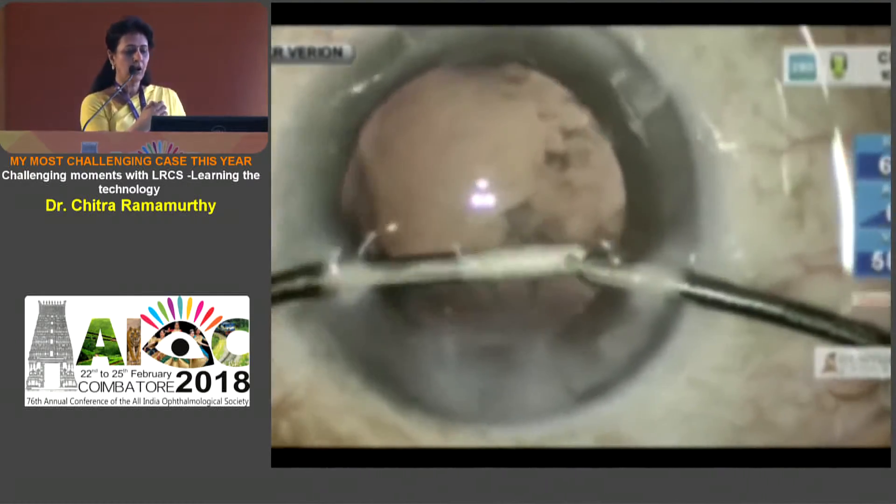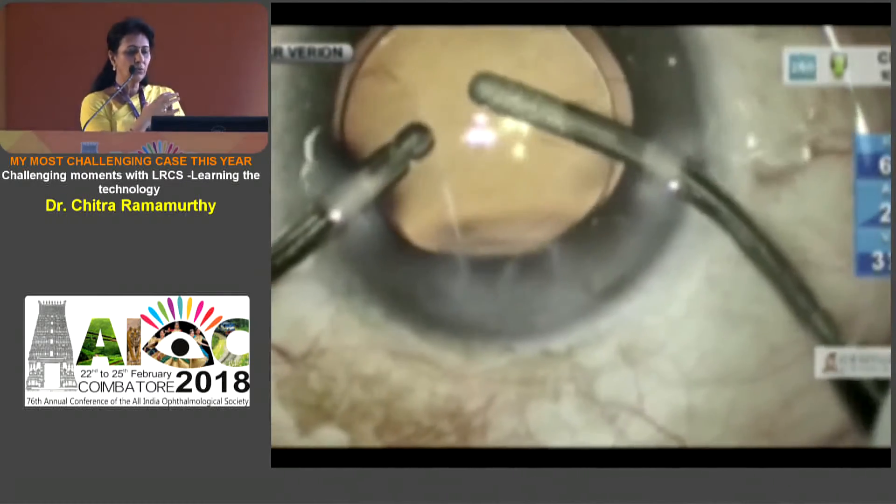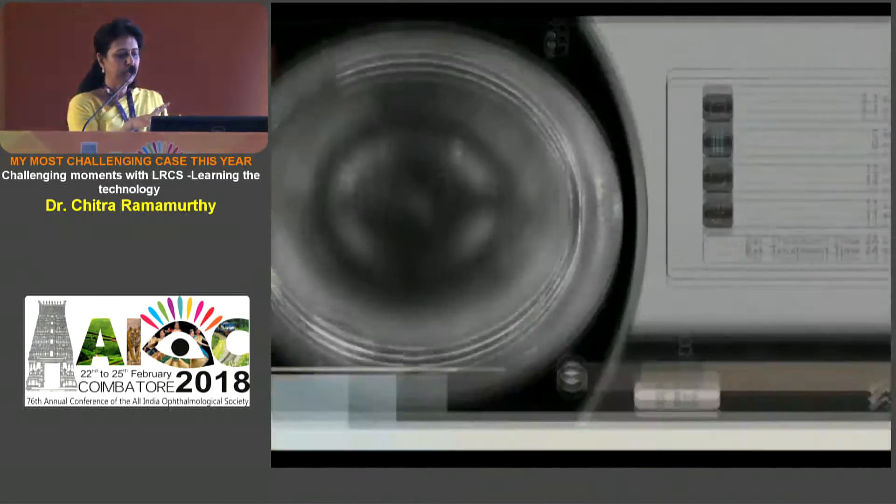The removal of the cortex is a bit of a challenge because it gets ensnared by the CTR, but it's mandatory. You remove all the cortex and then position the lens, and I got myself bailed out of this situation.